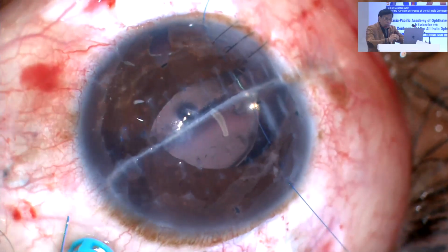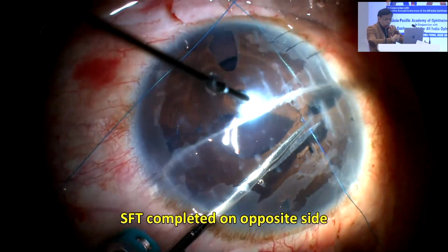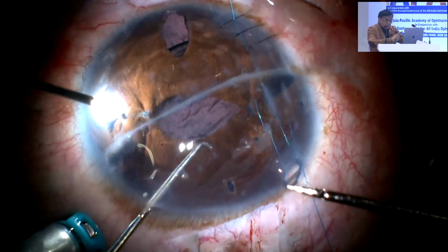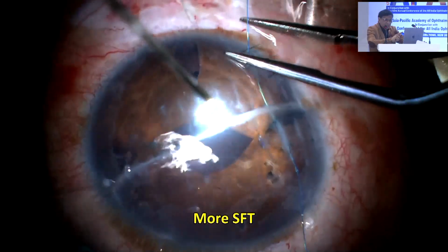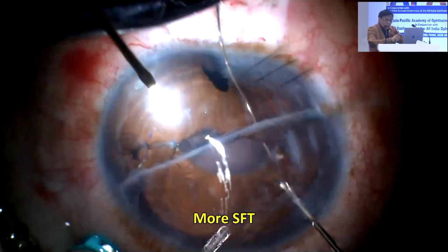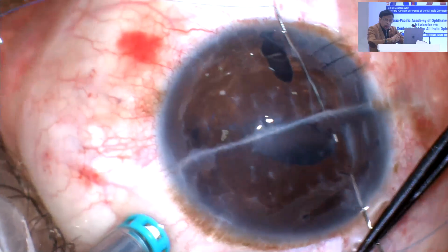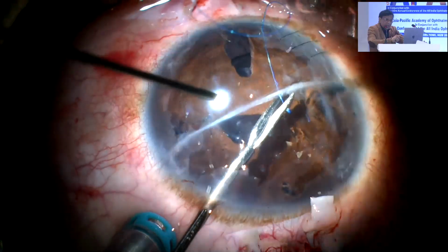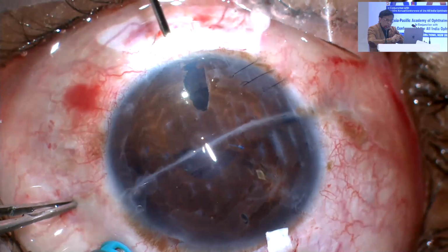But look at what I'm doing. As I'm doing slowly, you'll notice this pupil is becoming smaller and smaller. That small peripheral iridectomy is increasing, and if needed, I can even close that. Look at the endoilluminator trick, which I'm going to show you from outside, which helps me see better. As you can see, the pupil is becoming smaller and smaller.